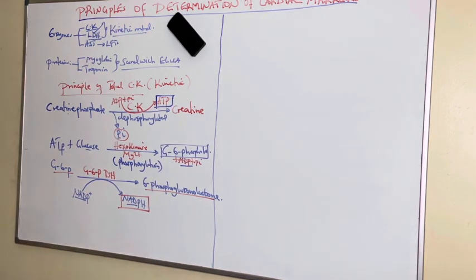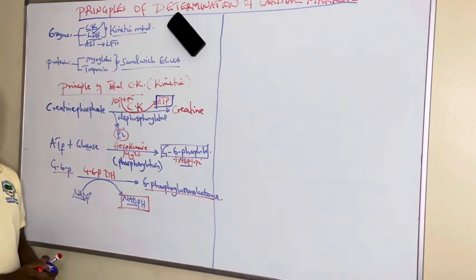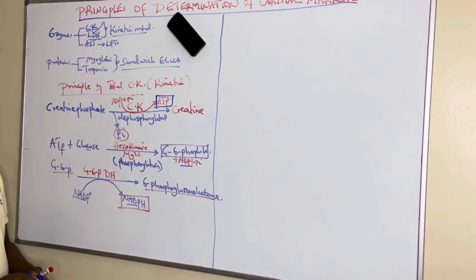So what we are interested in is the production of NADPH, which we are going to monitor continuously.